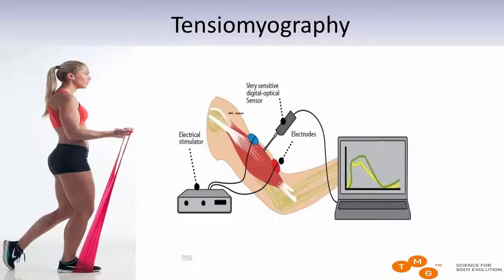In this display, we are measuring the biceps brachii muscle. In order to have standardized, repeatable, objective conditions, we are using an external source that will evoke muscle contraction.